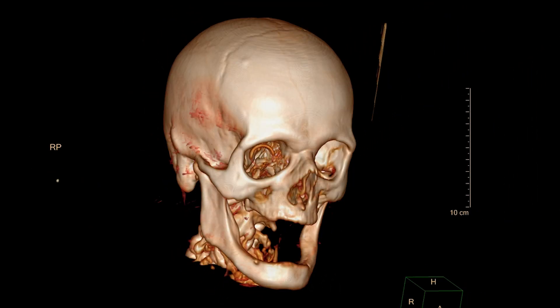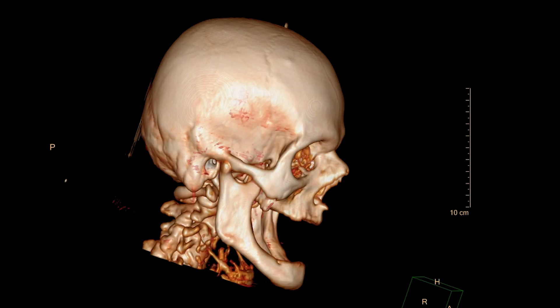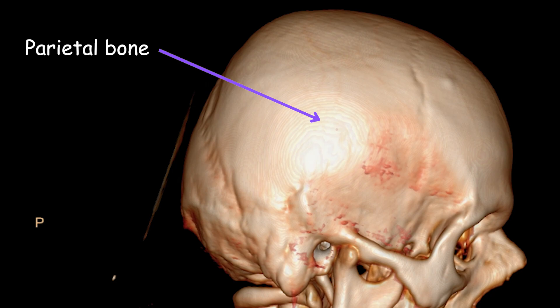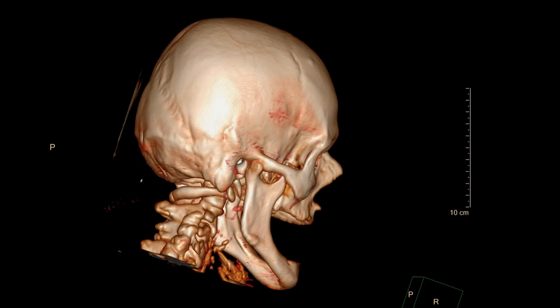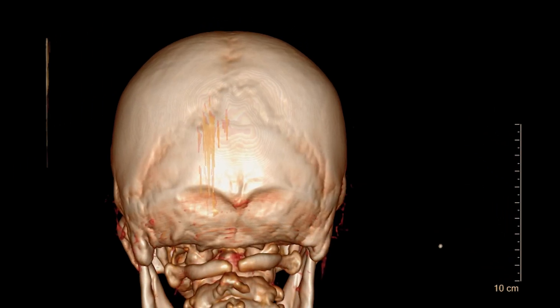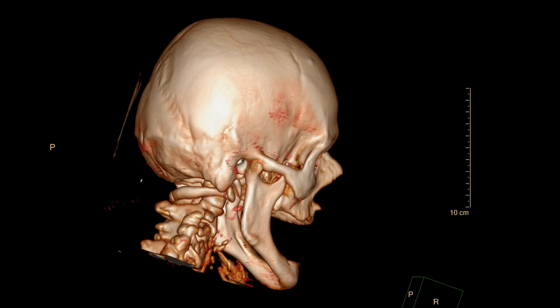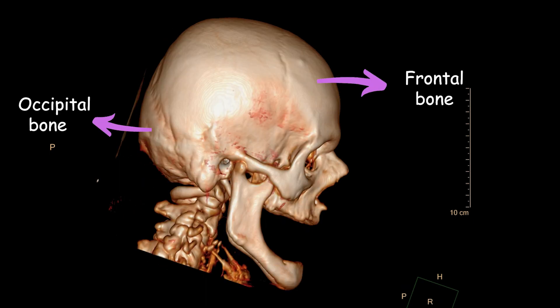The parietal bones are a pair of flat, curved bones located on the side and top of the skull. They form the majority of the superior and lateral walls of the cranium, are connected at the midline by the sagittal suture, and extend from the frontal bone anteriorly to the occipital bone posteriorly. They play a crucial role in protecting the brain, forming the cranial vault, contributing to the overall structure, strength, and shape of the skull, and providing attachment points for muscles involved in movement and chewing.